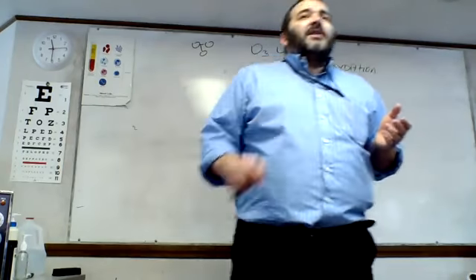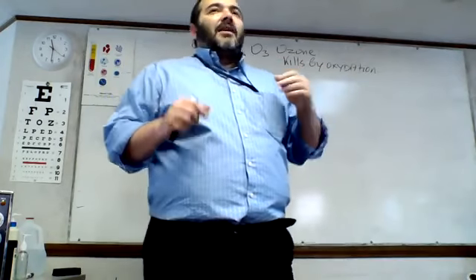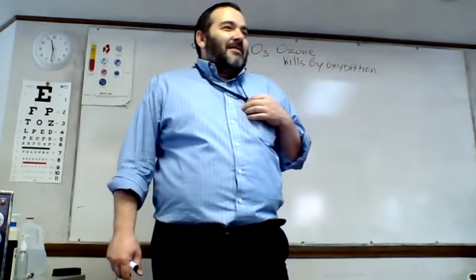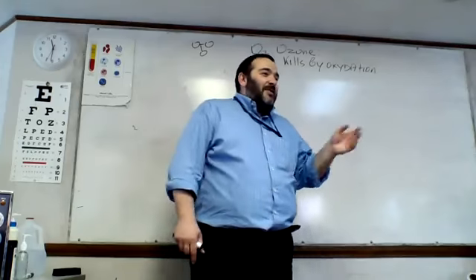So O3 is a very unstable form of oxygen. And how do we make it? It's like if you go on a date. Usually it's two people that go on a date. Let's not get into political aspects of it. Usually it's two people of the opposite sex.